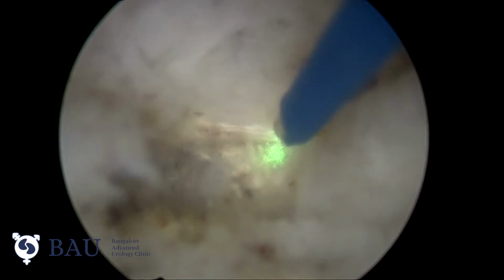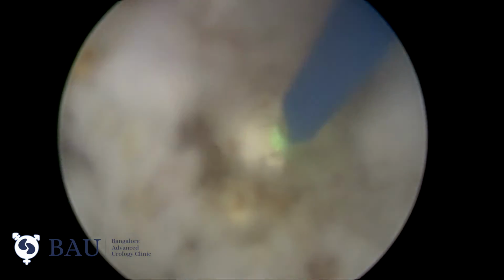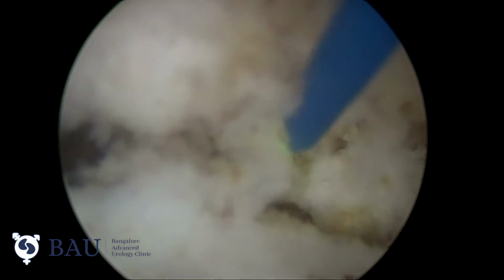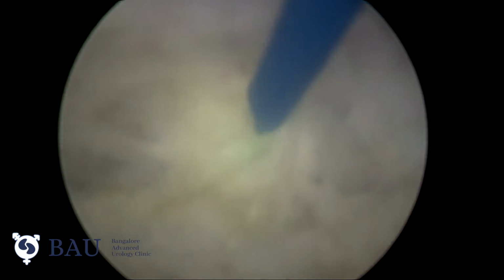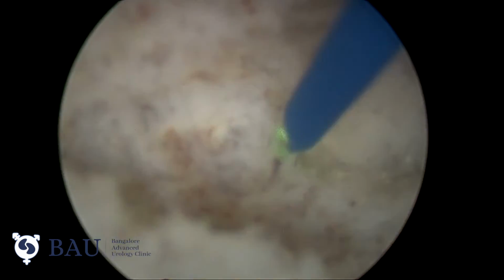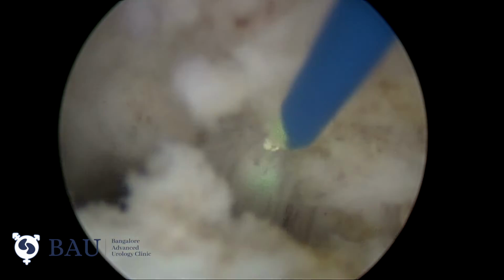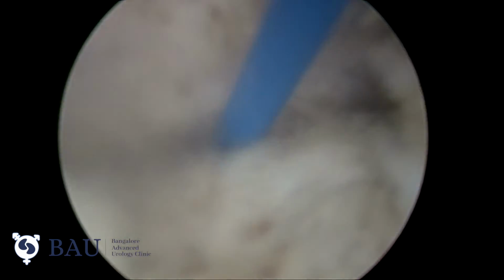We may leave some tissue near the apex. If the tissue is more, we can tackle that later, or if we retain some tissue near the apex in the anterior part, it should help in retaining more continence. So once we get the correct plane, just keep dissecting towards the bladder neck.